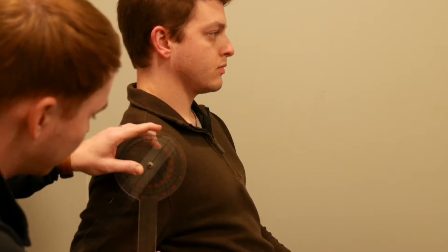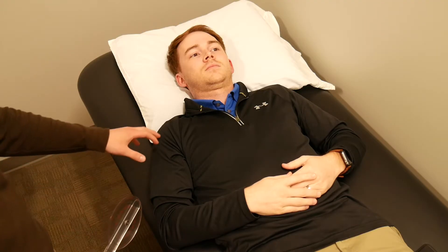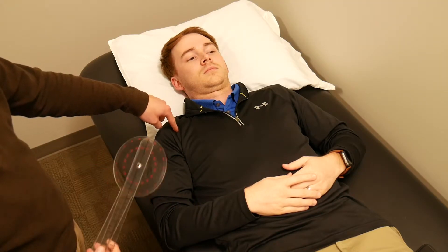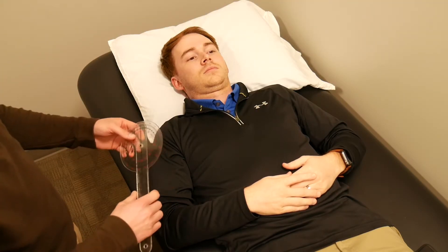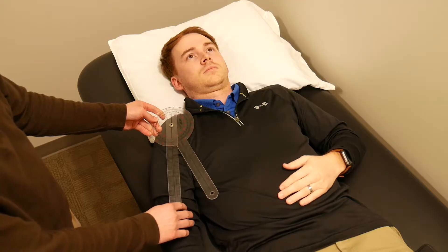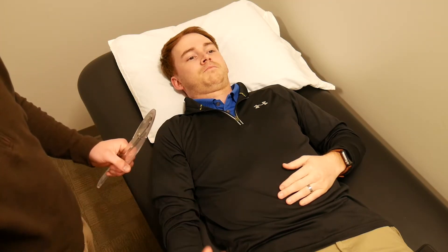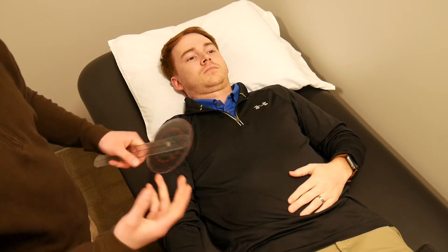Next we're going to be measuring shoulder abduction or adduction, and the patient is going to be supine again. For goniometer placement, the axis of motion is at the AC joint, so place the axis of the goniometer right over the anterior aspect of the AC joint. The stationary arm should be parallel to the patient's trunk, and the movable arm in line with the mid shaft of the humerus. One thing to note is that as the patient moves into position, following with the goniometer can get a little difficult sometimes and you can fumble around.